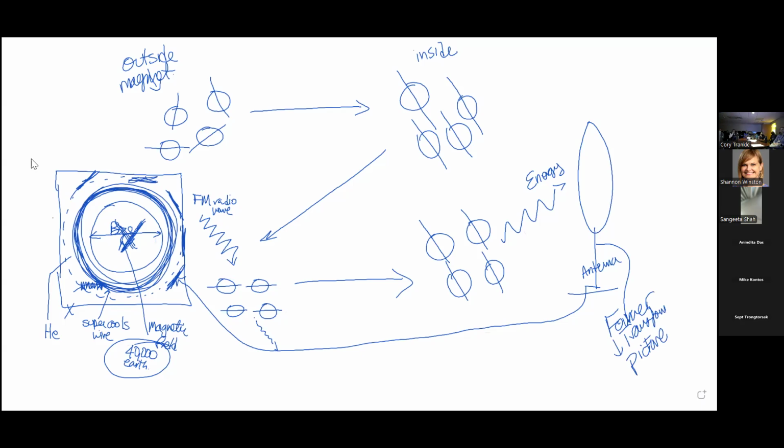Okay. So the second reason the magnet is in the room is because we've got to stop any other electromagnetic radiation from interfering with the picture taking. Now, it's very interesting because the frequency that it uses is 88 point something megahertz, which, since you live in Richmond, Virginia, you're going to see something called, I think it's called WTVR.